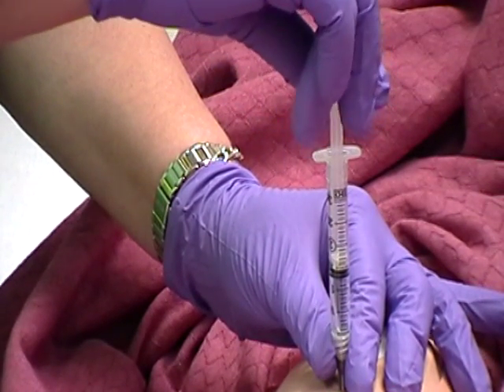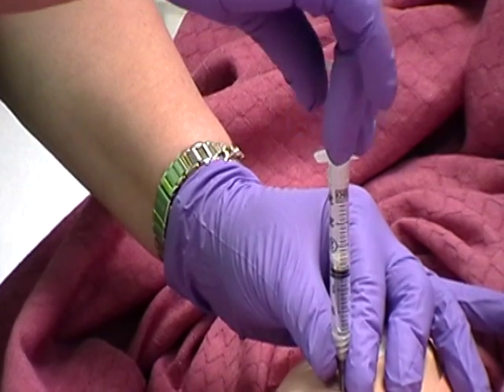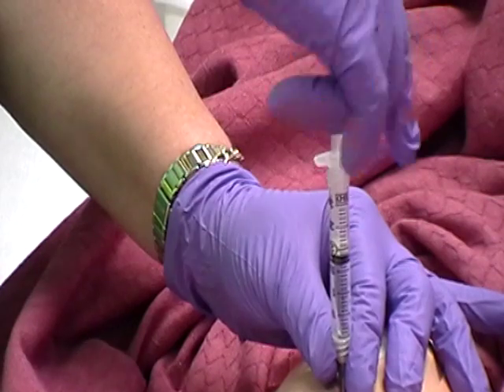Move dominant hand to end of plunger. Do not move the syringe. Pull back on plunger 5 to 10 seconds. If no blood appears, proceed with injection.